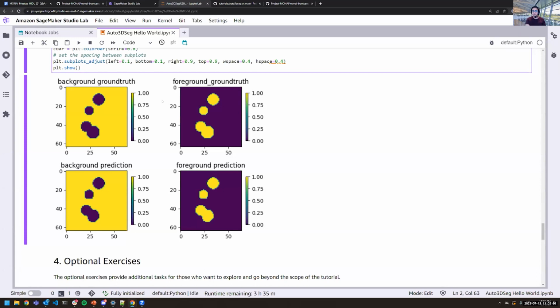And then you can test it out pretty easily. So if you were to increase those numbers to 5, you probably would have it perfectly matching the ground truth for the prediction. But it kind of walks through the general workflow for it.